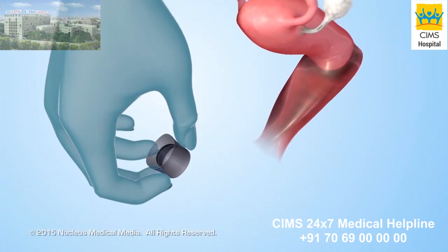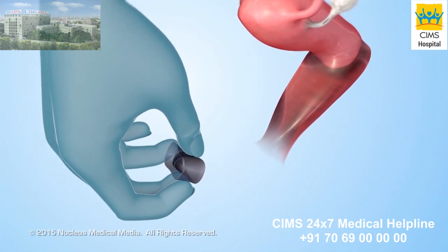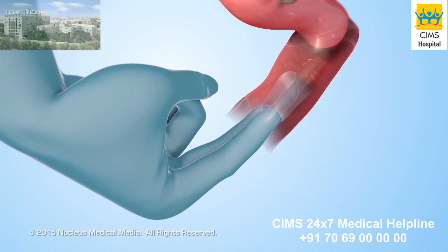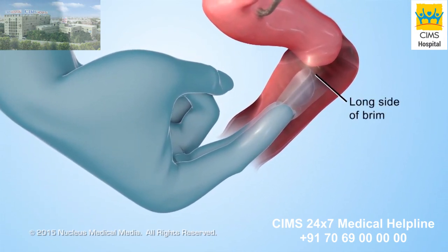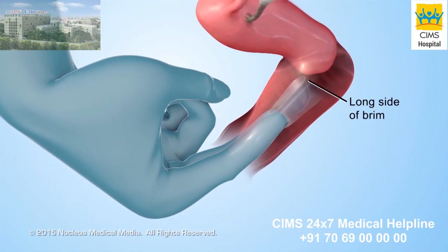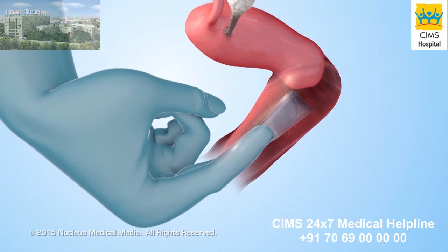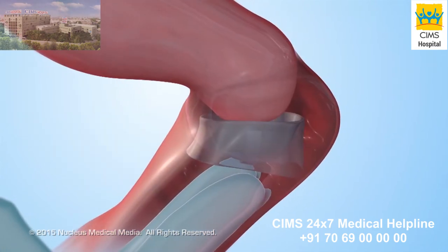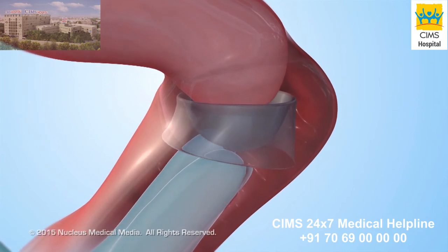Next, squeeze the cervical cap with the dome facing away from your vagina. Then slide the cervical cap into your vagina with the long side of the brim entering first. Using one or two fingers, slide the cervical cap as far into your vagina as it will go. Check with your fingers to make sure the cervical cap touches and completely covers your cervix.